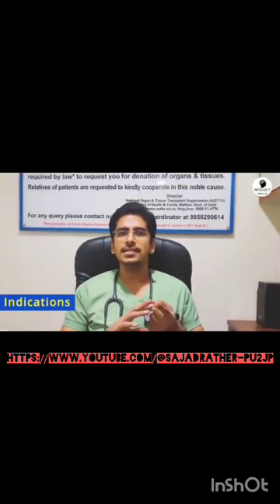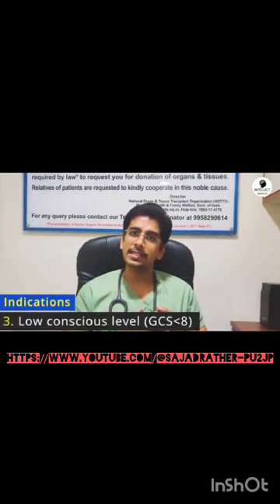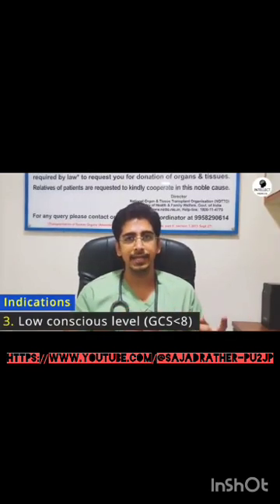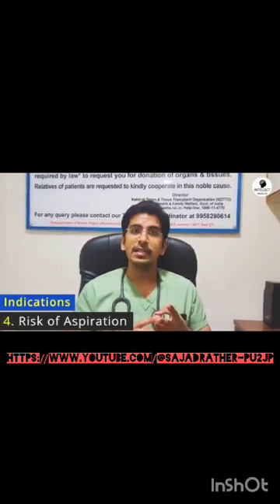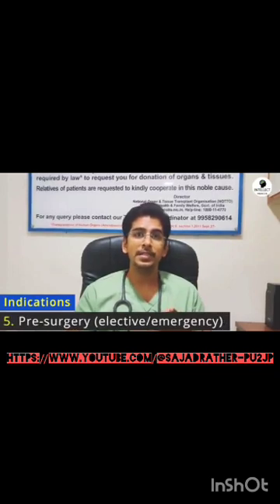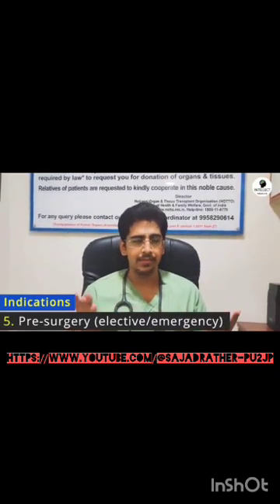Now, starting with the indications, the first and foremost is during a cardiac arrest or during CPR. Second, if the patient is in respiratory failure, it could be hypoxic or hypercapnic. Third, if the GCS, the sensorium of a patient, is very low, less than 8, that is an indication of intubation. Then fourth is a patient at risk of aspiration. Fifth, a patient before surgery, elective or emergency.